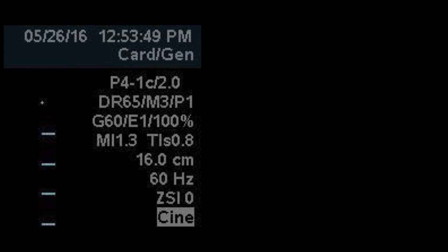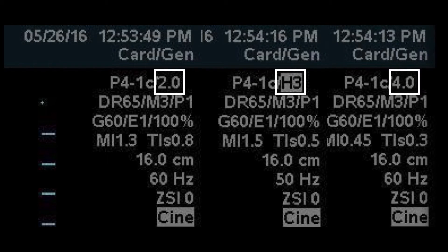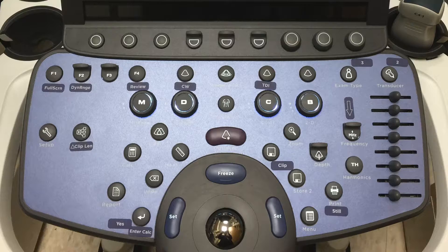You can see here this probe — the phased array — is imaging at 2 megahertz, with 2 displayed at the lower end of the 1 through 4 megahertz frequency range. We've moved up to 3 megahertz and then 4 megahertz. As you toggle up or down you will increase and decrease the frequency, displayed by the number with the range shown next to the probe.